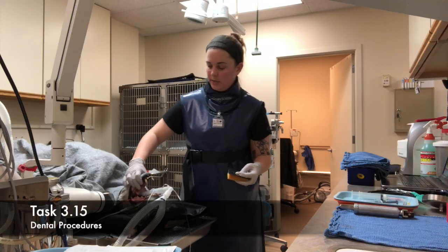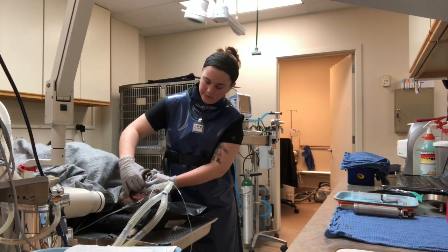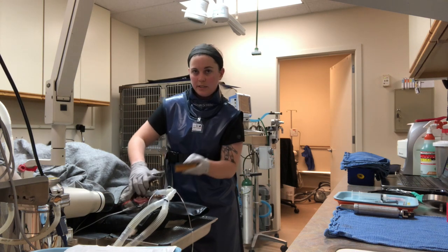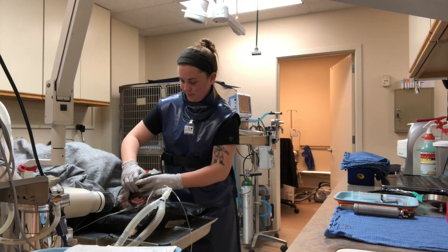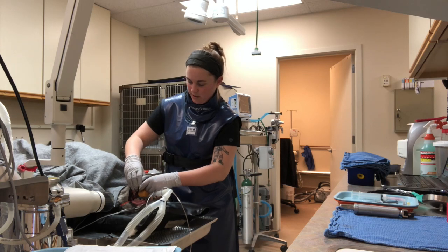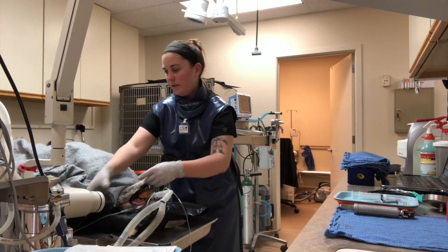Taking mandibular x-rays, I have Austin in the dorsal recumbency position. So I have his tongue stuck in the back here to get it out of the way. And I'm going to use a phosphor plate since he is a large dog. What I want is his premolars on the right side here. So I have the plate with the teeth lined up on the edge of my phosphor plate.